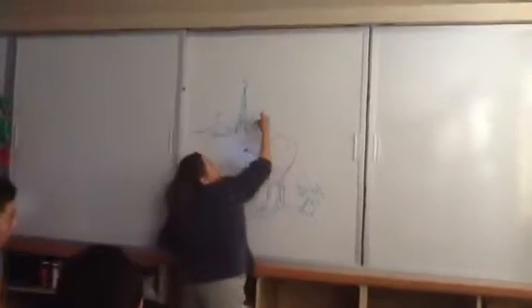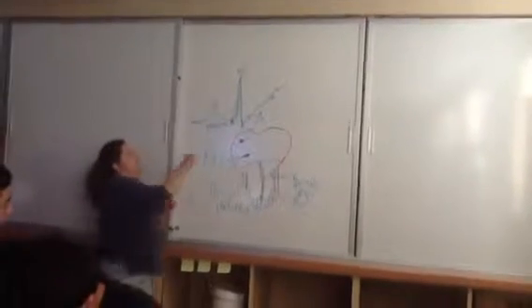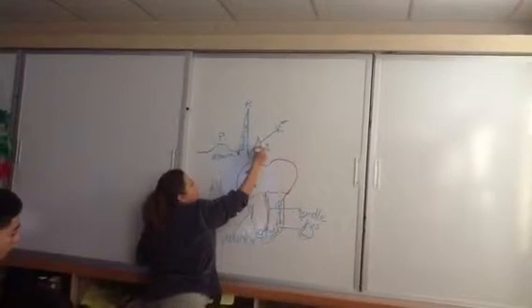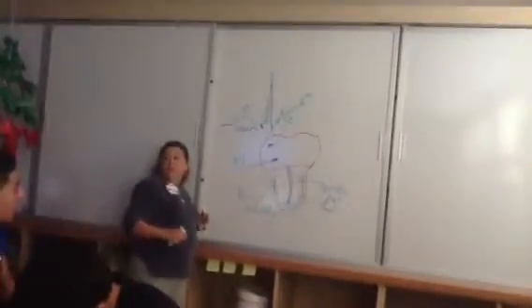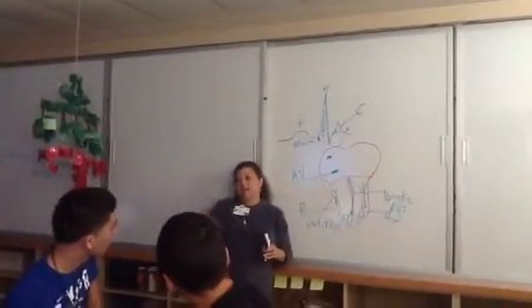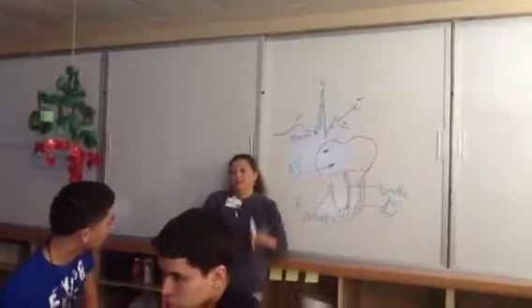This is your potassium right there. Your potassium affects that. If the potassium is high, you're going to see the T tented, like a little QRS but down at the bottom. Why does that happen? Because remember the drawing that I did of the cells? All the potassium is inside the muscle fiber, so it can't relax. So that's why it's staying like this.